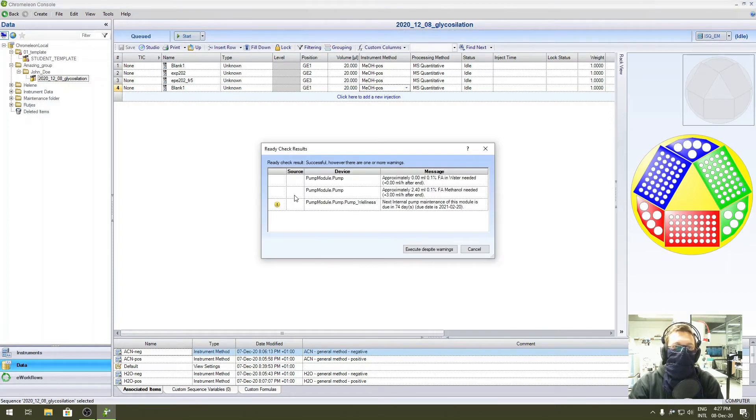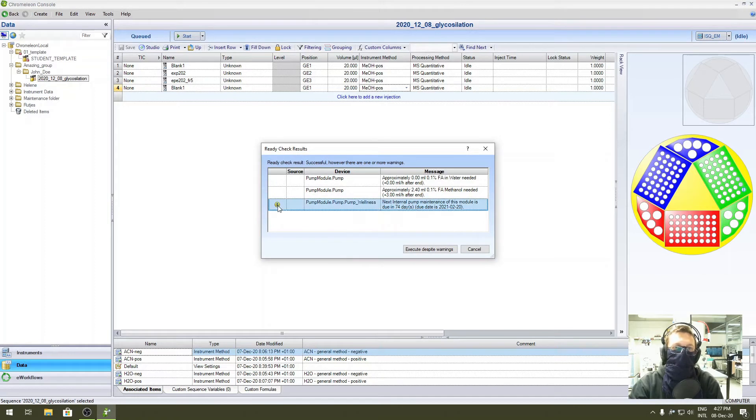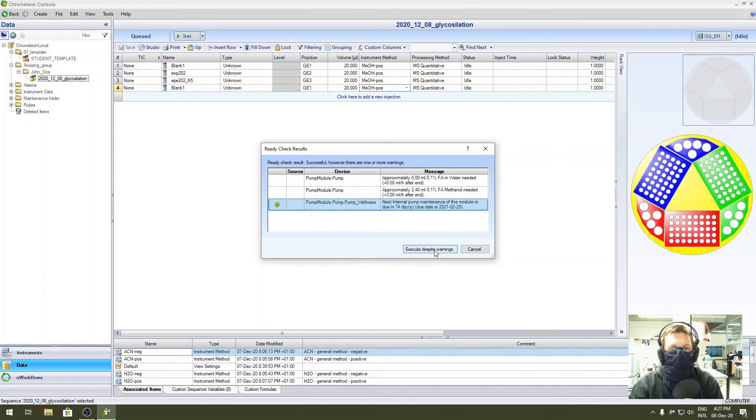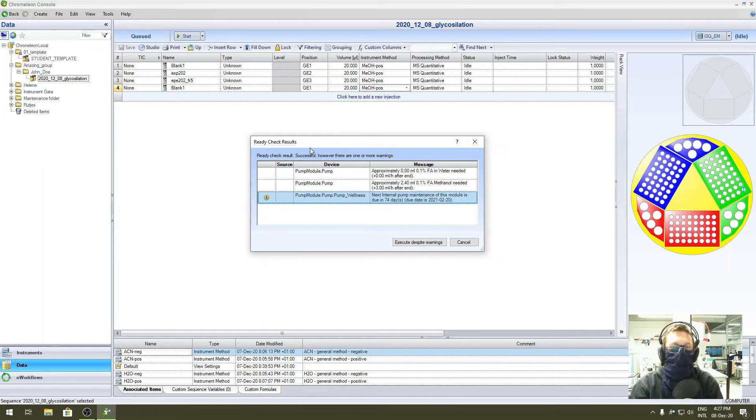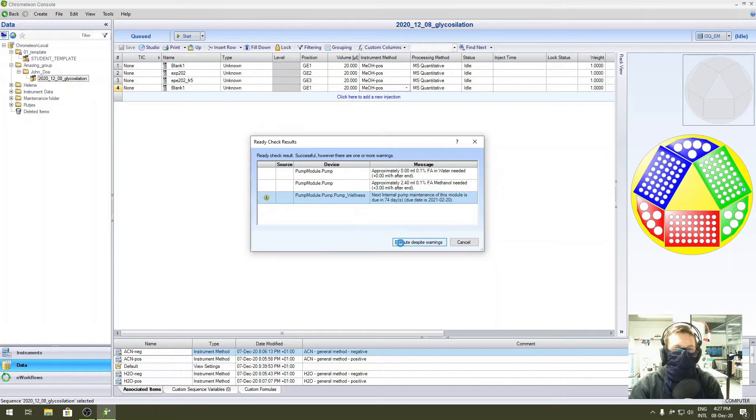If you see an error with an exclamation mark, contact me. For this time I know what is going on - I wanted to show you what can happen so you can expect it. I will execute despite the warnings.